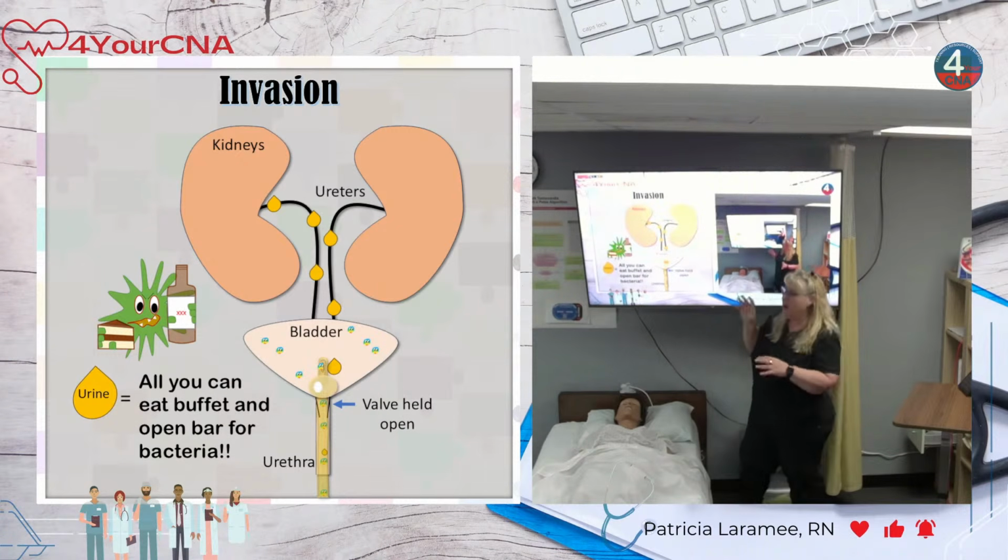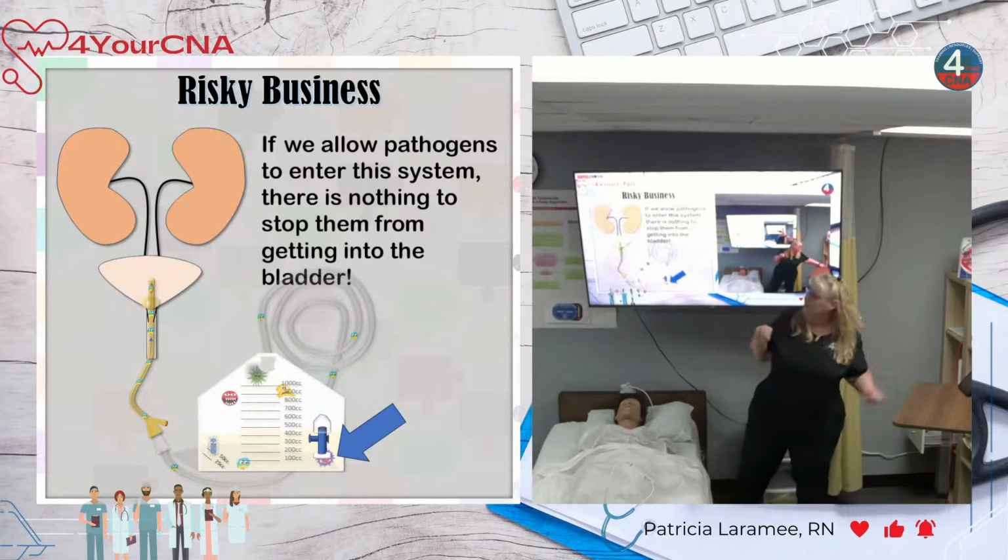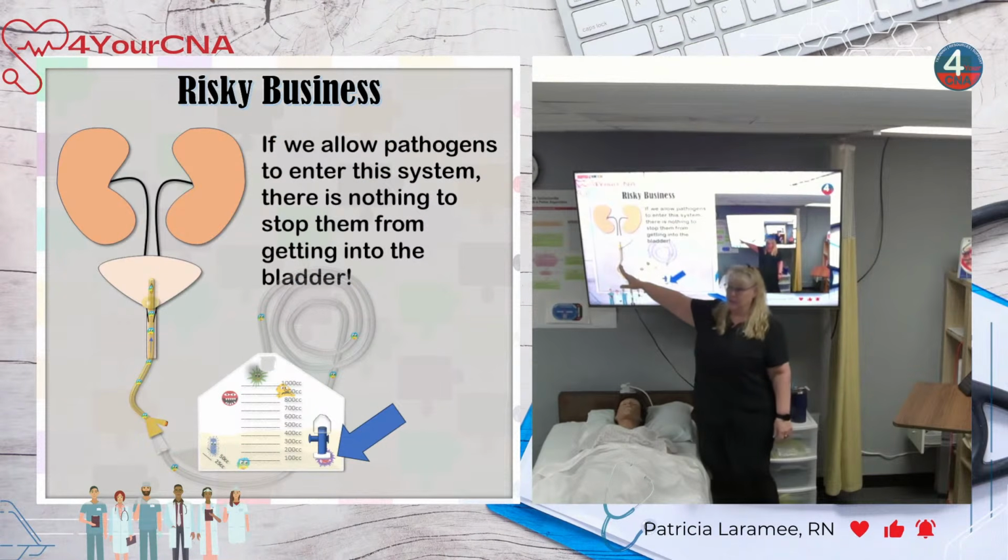This is why, let me go back one, this is why catheters and bags are changed at different intervals. It takes a long time for a bacteria to make that journey. So if we change this bag out weekly, chances are any bacteria that's in here, we're going to get them before they get here. That's why bags need to be changed more often.